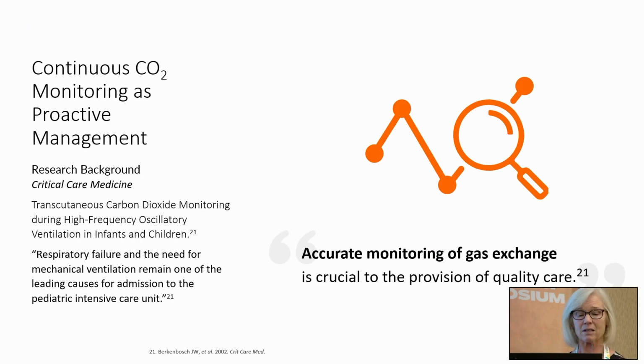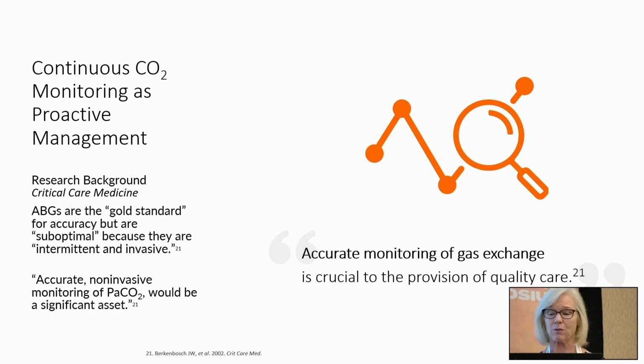Okay. I wanted to get into one of the best things about transcutaneous CO2 monitoring, and that it does allow you to have proactive maintenance of your patients rather than reactive maintenance of your patients. So there's this study, it was a pediatric ICU, and they wanted to see if transcutaneous was a viable option to use on their patients who were on the oscillator. First thing, because they don't want to do blood gases on these kids, and they also couldn't use end-tidal on these kids, the first thing they wanted to do was make sure that it was accurate.